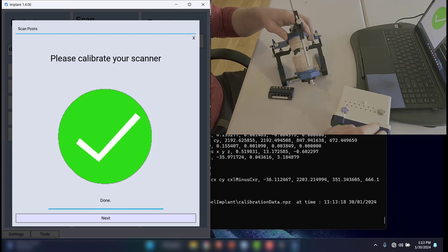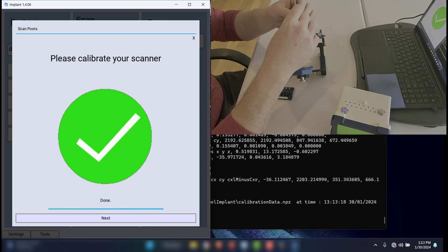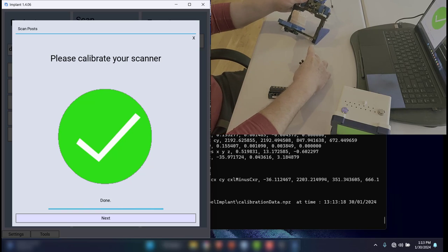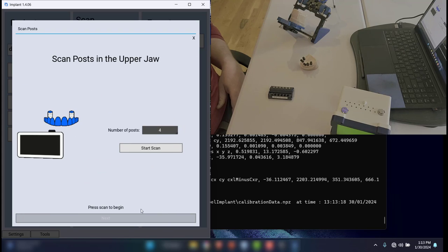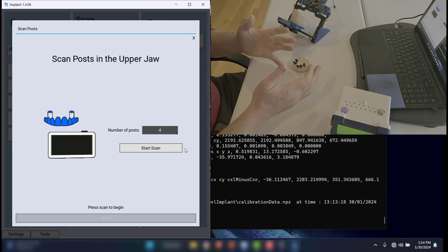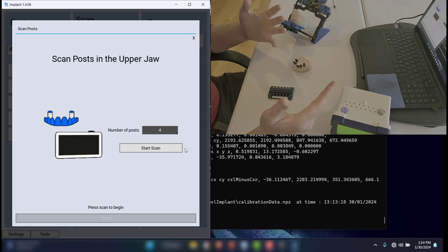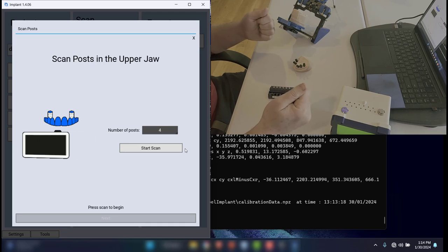The first time I got this, I was trying to use it and run it through its paces, and just to make my own life simple, I just thought, well, I'm gonna just do this on the bench top. So I took this model off. I told it to capture the upper posts. All right, we'll click next here. Told it to capture the upper post, told it how many I was using, and then I sat here scanning and nothing was happening. Calibration went perfectly, everything seemed to be going perfectly, and the camera was active in the background. I could see something happening, but no scan posts were being captured.